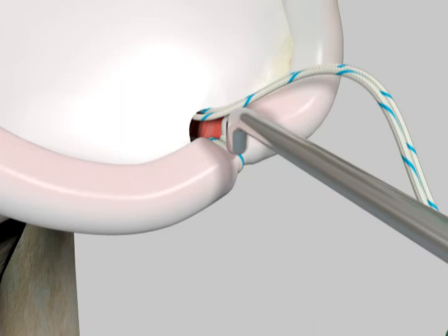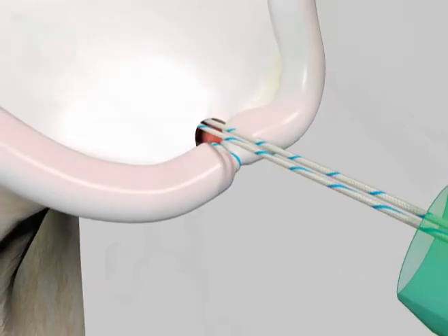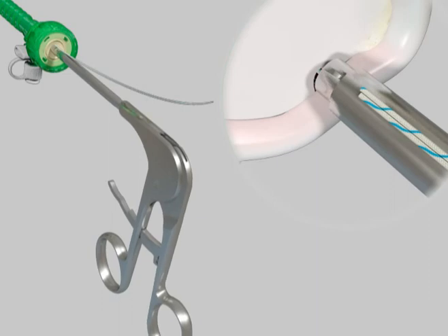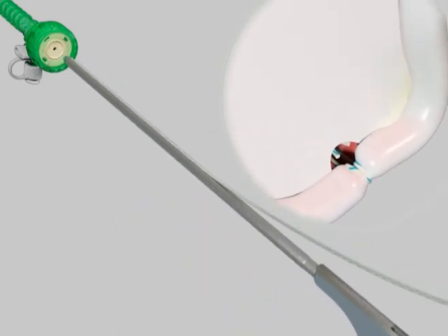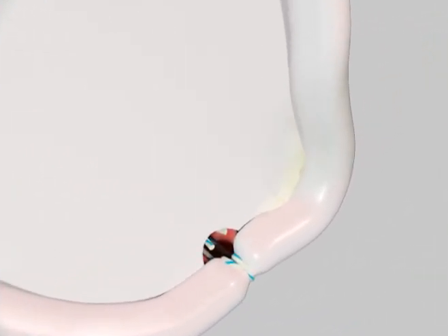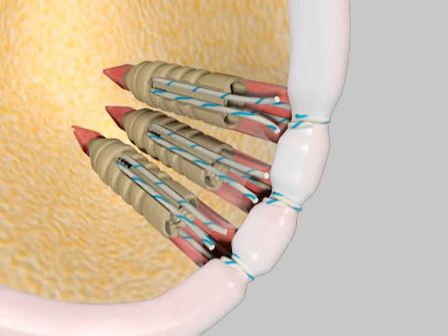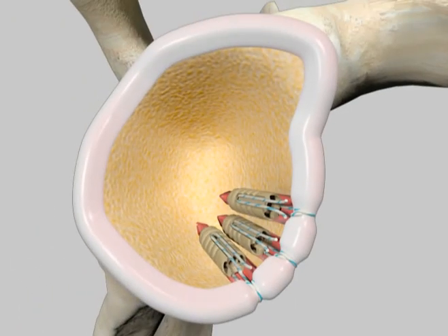Probe the repair to verify the proper repair is obtained, then cut the suture limbs to complete the first anchor repair. Repeat with additional anchors until the desired repair is obtained.